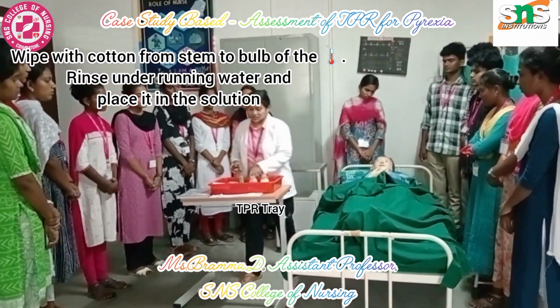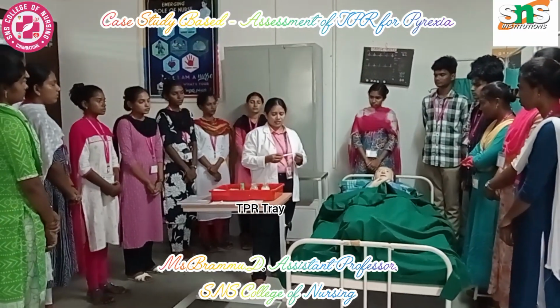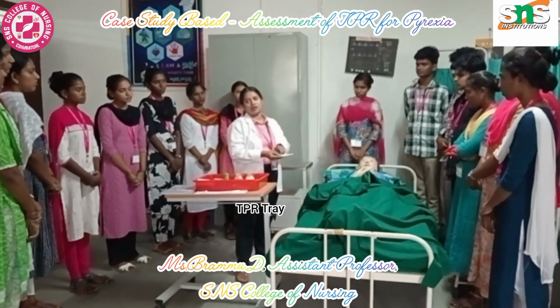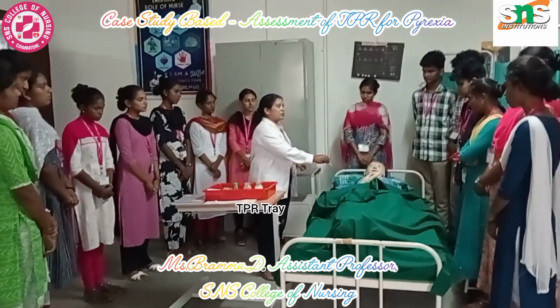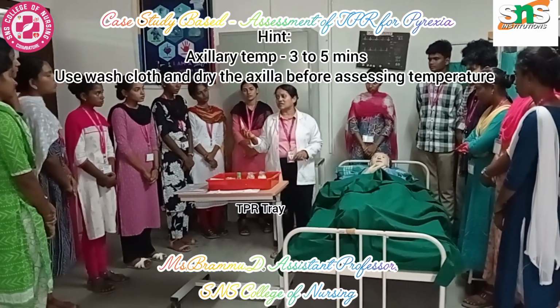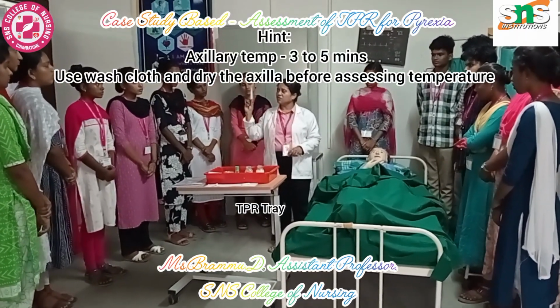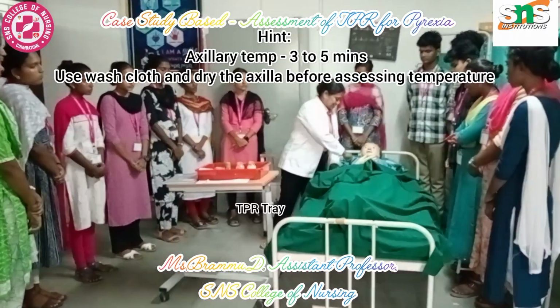If it is a digital thermometer, you are going to use the digital thermometer and see that it is in working condition. Just click the switch on and off button. Once you hear the beep sound, you can put it onto the patient's axilla, because if it comes into contact with saliva, the thermometer's durability will be lost. That is why, for a digital thermometer, mostly we prefer the axillary route.